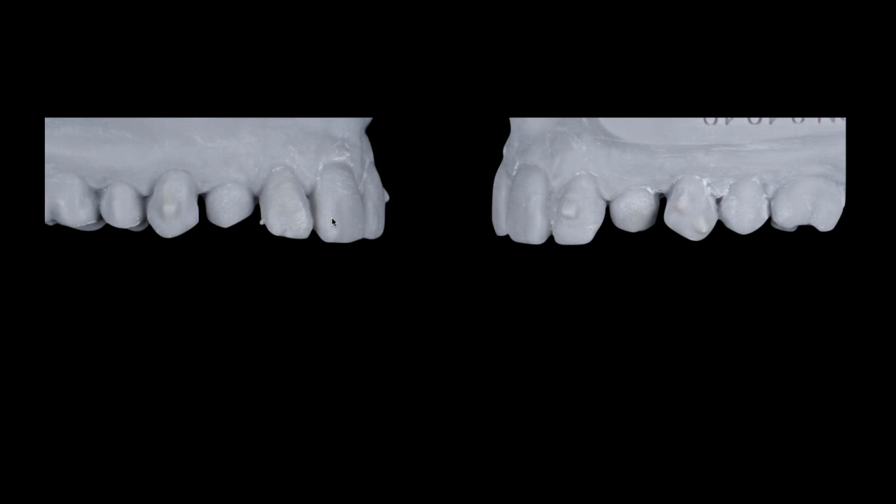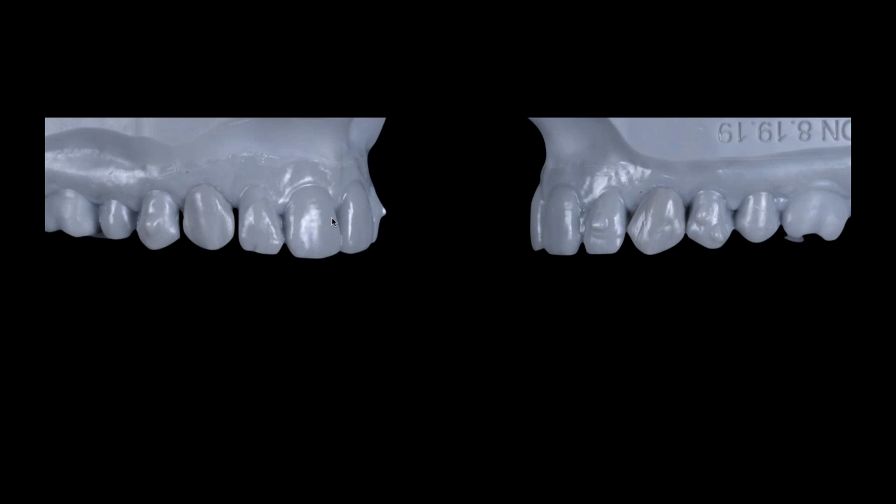So what would I do with something like this? I could design it digitally, but I have to be honest and tell you, this is a 2-minute wax-up. Jen can actually grab some gray wax right on the digital printed cast. And here's the beauty of this. It was coincidental, by the way, and I'll be showing some of this at the DLOAC in Cali next month. It was coincidental that our gray waxes and our white waxes almost perfectly mimic the color of our gray printing material and our white printing material. So it was really kind of cool when we saw it.